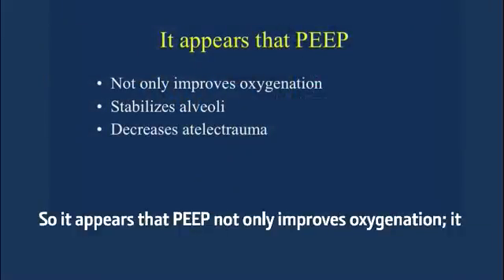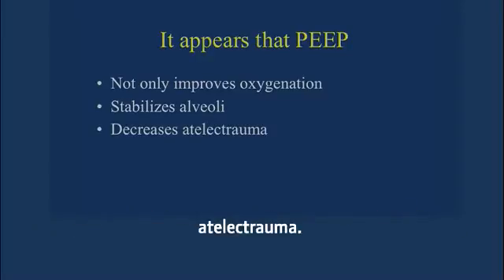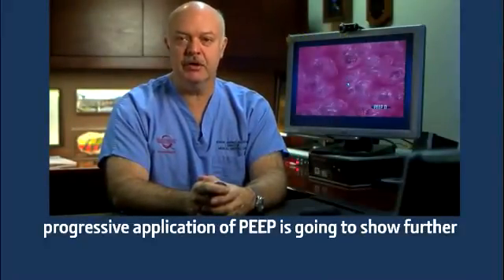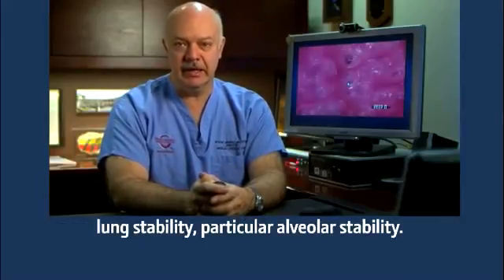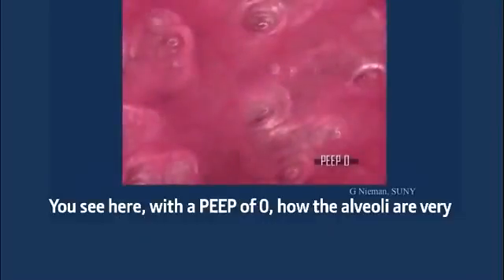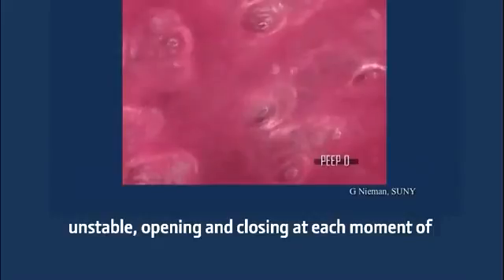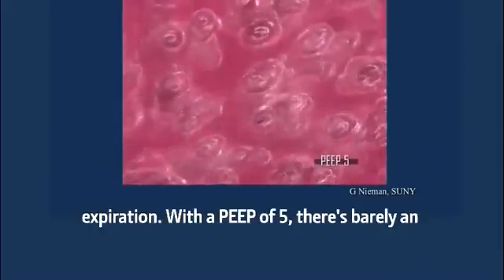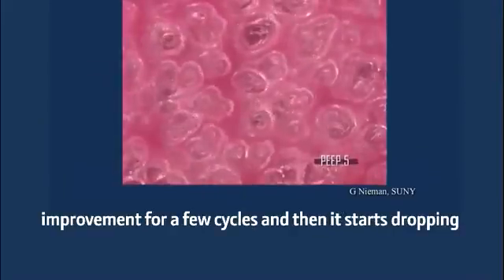So it appears that PEEP not only improves oxygenation, it also stabilizes alveoli and probably decreases atelectrauma. In this model, we're going to show you how the progressive application of PEEP shows further lung stability, particularly alveolar stability. You see here with a PEEP of 0 how the alveoli are very unstable, opening and closing at each moment of expiration. With a PEEP of 5, there's barely an improvement for a few cycles and then it starts dropping again.